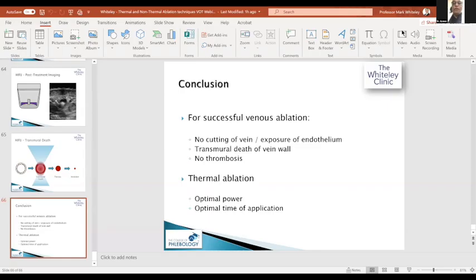It is a very interesting talk, and really, I think, will deviate our thoughts to many things. As you told us, the transmural death depends on the vein wall thickness. And I think I will ask Dr. Erwin Tudner from Netherlands. Do you think, Dr. Erwin, in your practice and in doing duplex, that you have to pay more attention to the vein wall thickness after this lecture?